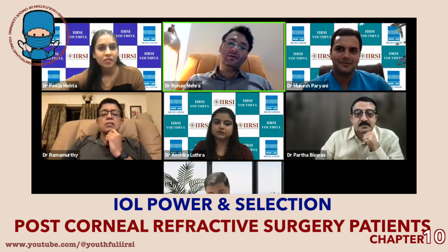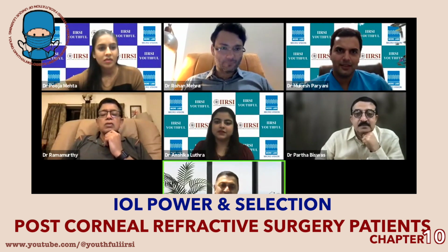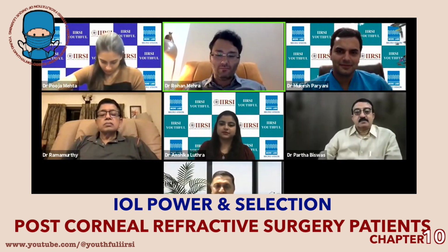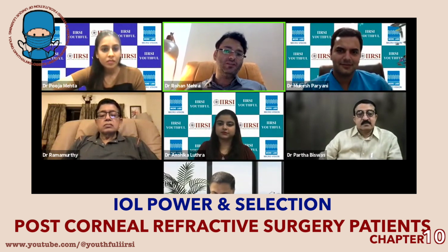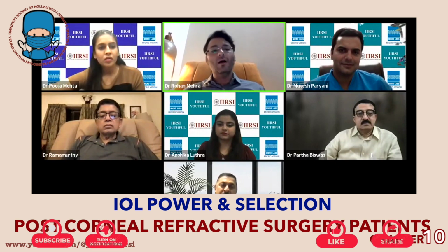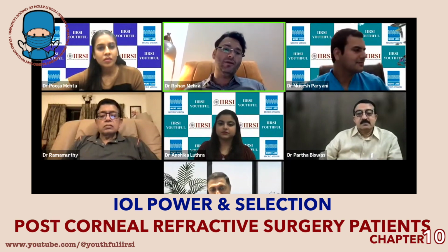Because as you said, nowadays, all of us are getting trained at bulk centers where we get a lot of surgeries. So we're used to using different phaco machines, and even with a basic phaco machine we're all right doing surgery. But the biometry part we will never be able to take care of, because it's not equal. I agree that all phaco machines are not equal, but since you got trained with so many cases already, you can handle it. But when it comes to biometry, it has to be accurate.